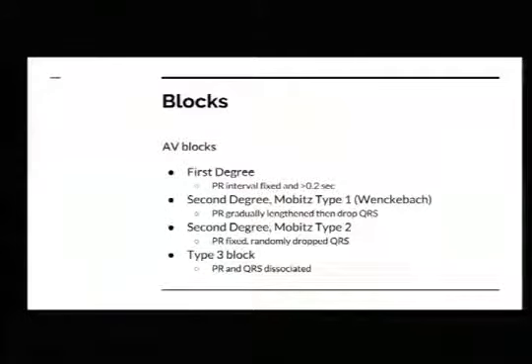In the Wenckebach, your PR gradually lengthens. So you have variable PR and variable QRS. Your PR interval gets longer, longer, longer, you drop a QRS, and it starts over, longer, longer, and drop. Whereas in Mobitz 2, your PR intervals are the same every time, except when a QRS just disappears. Otherwise, all the ones that have a QRS following a P have the same PR interval. Which one's worse? Right. Type 2 is the worst, besides type 3 block.